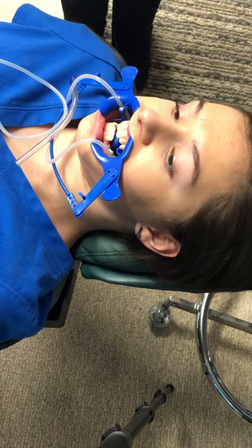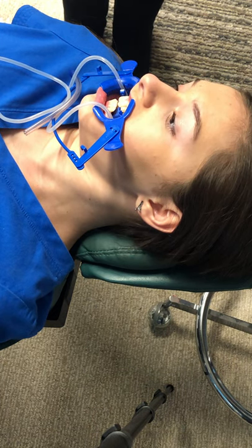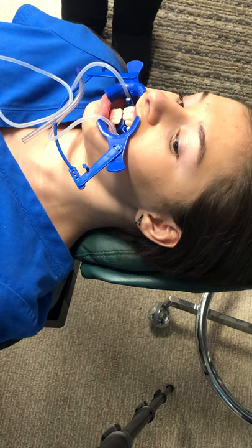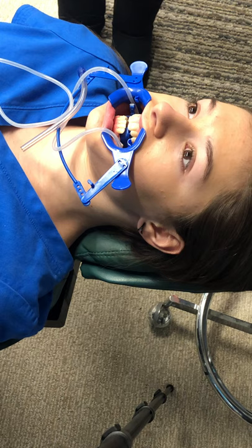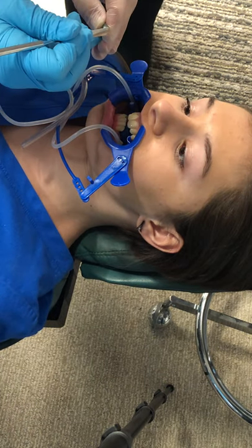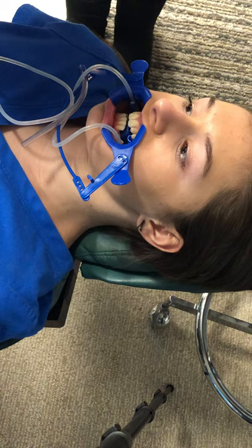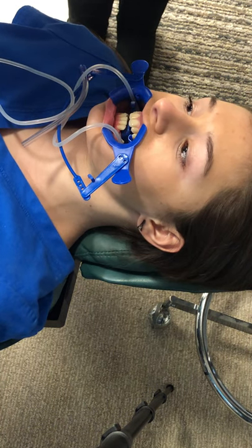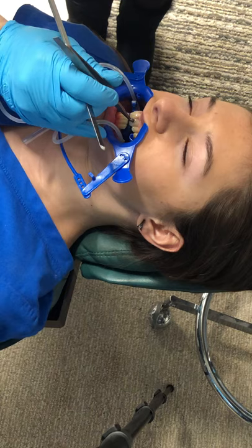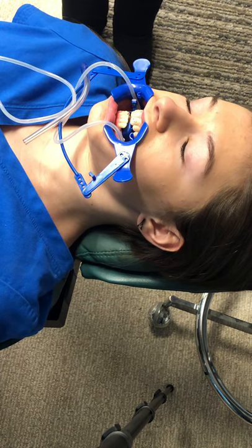I'm going to take the light paste — this is your glue. Squeezing that together a little bit so it doesn't move on me and shoot across the room. This is light cured, so you don't want the bright light to get on it. Take your spatula and push that into the back of the bracket. The back of the bracket has a mesh pad on it, kind of like a window screen. Build up a thin layer, then place it.